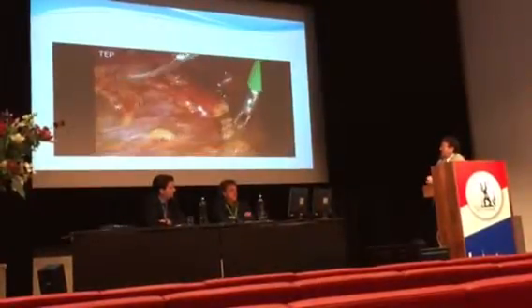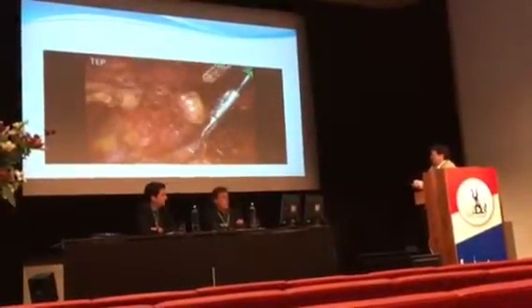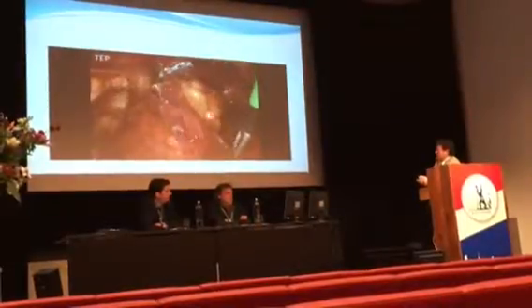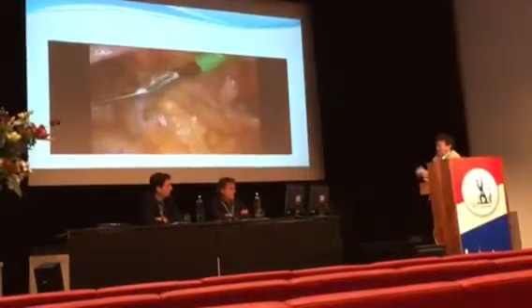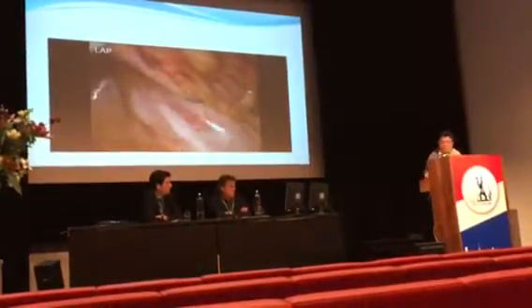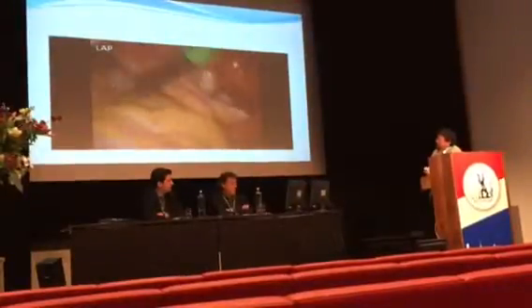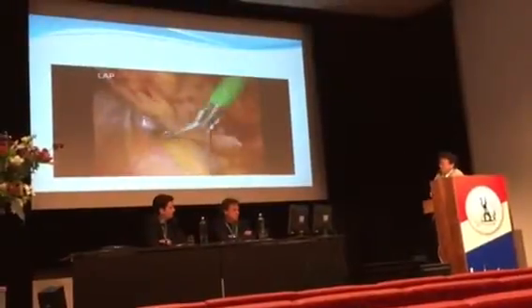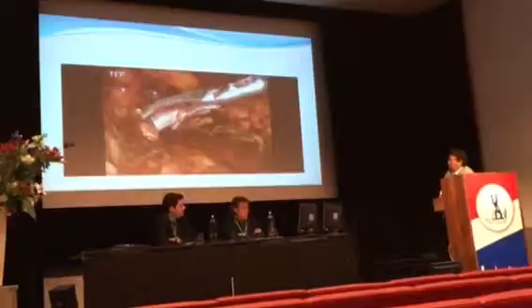Once you get to the intra-abdominal view, okay, now you're in the intra-abdominal view. You find the sigmoid colon has herniated through an indirect sac, and it shows some signs of inflammation due to chronic incarceration. And then you come back to the TEP approach.